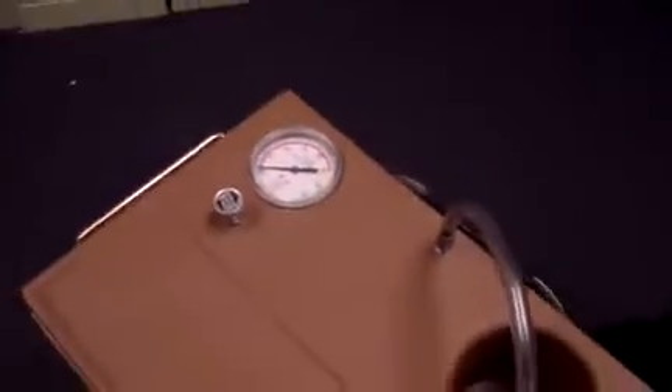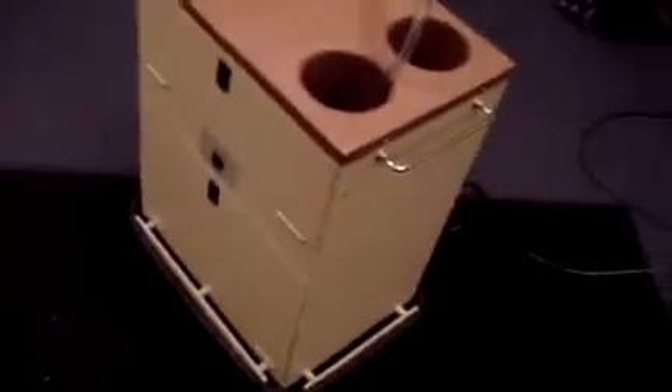You can see the inside there — everything looks pretty clean. We'll go ahead and turn it on there. If you have any questions or want more info, feel free to reach out to me. I do not have any canisters for the unit. Everything you see here is what you would get.